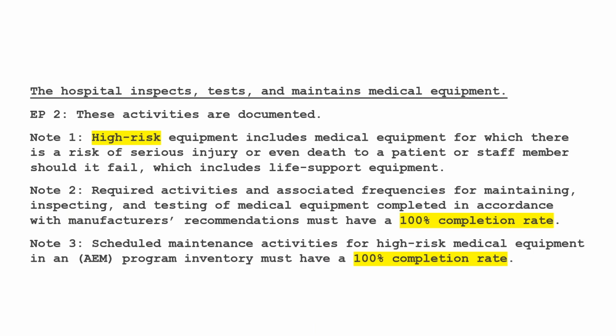If you're in charge of that policy, it's something to review. Make sure your staff is aware of it. If you're not aware of it, reach out to your managers or directors to see what that policy is. Part of that scoring is, if that equipment fails, what are the consequences? What are the risks of that equipment? That's usually what makes it fall into high risk. There are some other factors that usually put it in the high risk category as well.